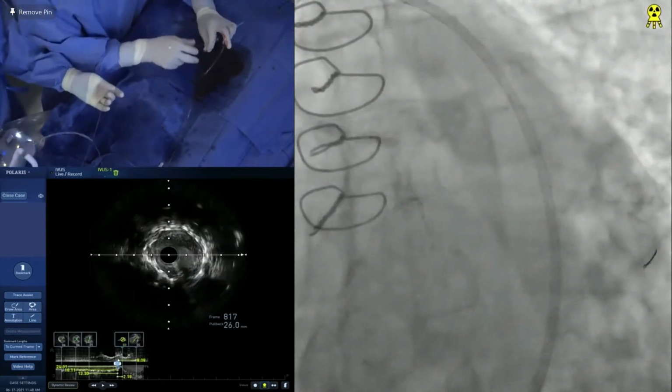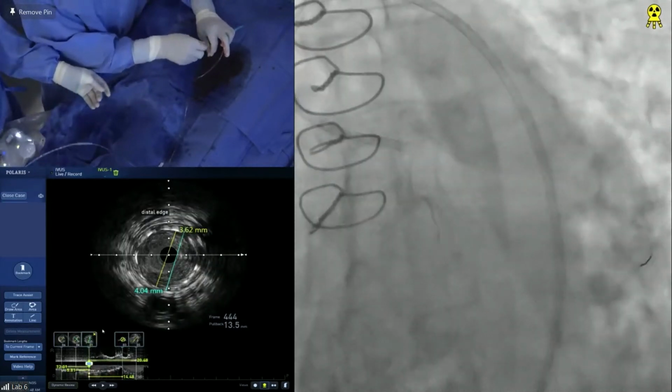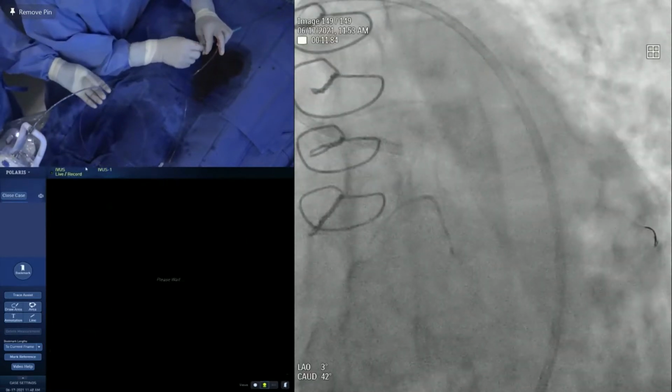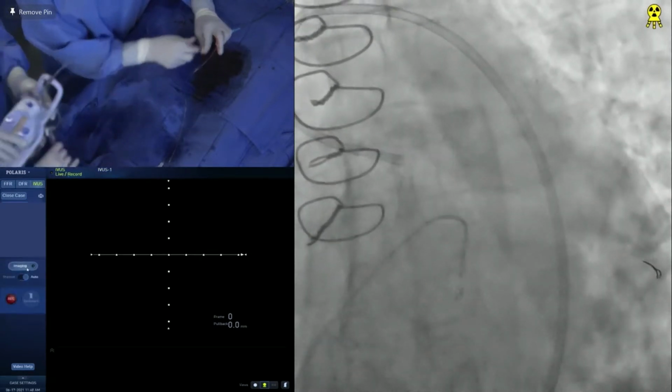Okay. So let's see, would your approach be different? There is a trick. Maybe I should not mention. It's very off label, but in many places they don't have a rotablator burr bigger than 1.75. They don't carry.